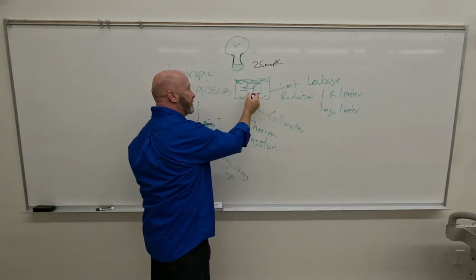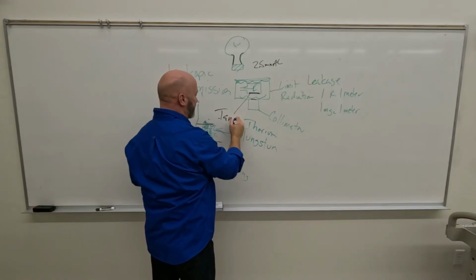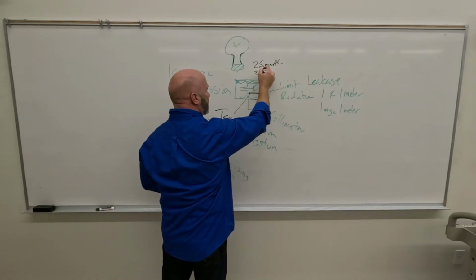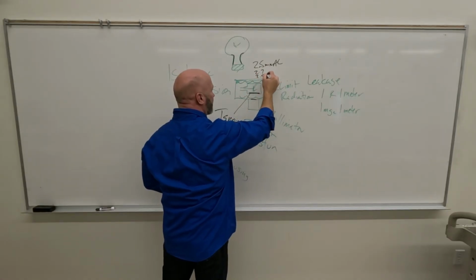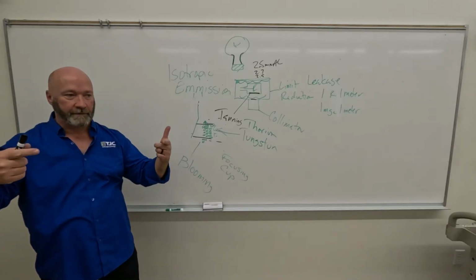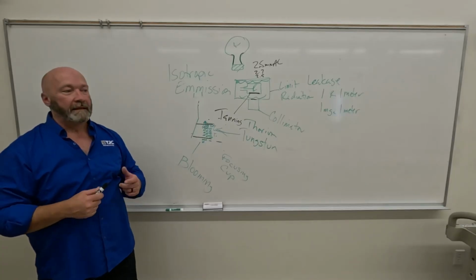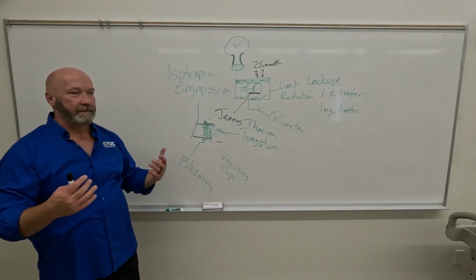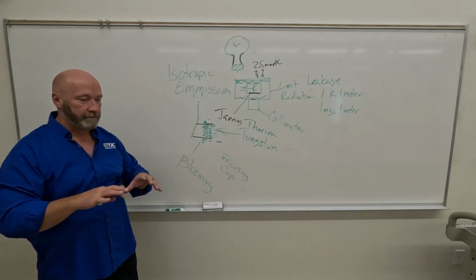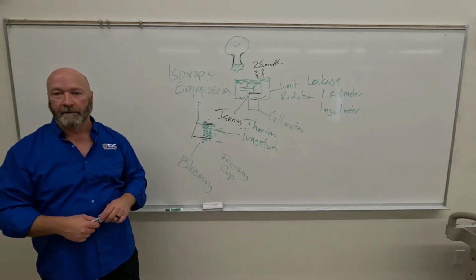Over tube life, because of tanning of the x-ray tube, that 2.5 millimeters is going to slowly climb, 2.9 and so forth. It's going to increase the inherent filtration in the x-ray tube. It's going to do something else too though, and that is, it's going to change the electrical potential and the electrical tendencies of the x-ray tube.